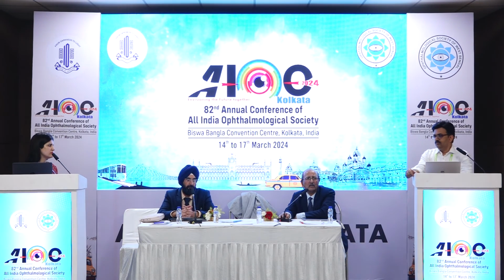Usually we do whatever dilatation we achieve before starting the surgery. That is our first aim, and during surgery or at the end of the surgery we have not used atropine. My intention was to prevent synechiae. No, you are right, but if there is synechiae, atropine vision will be clear. So I think homatropine is a better option if you want to put it at the end of the surgery.